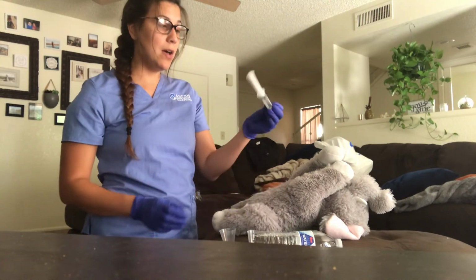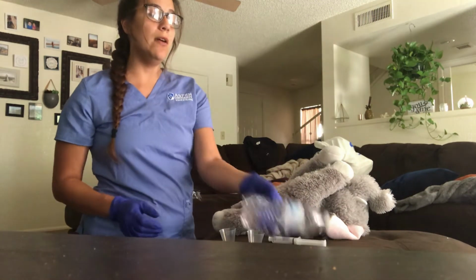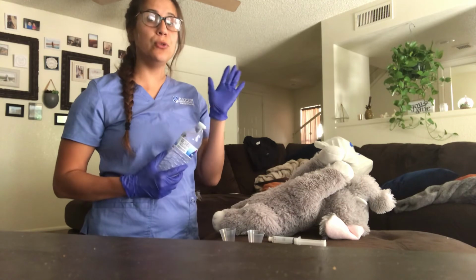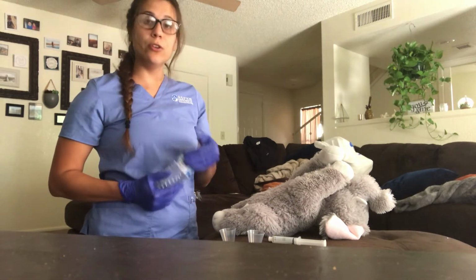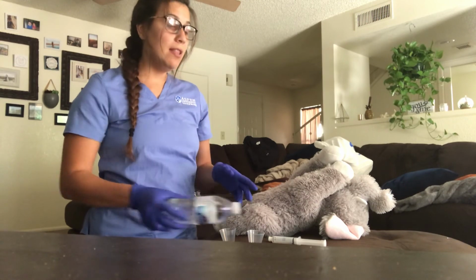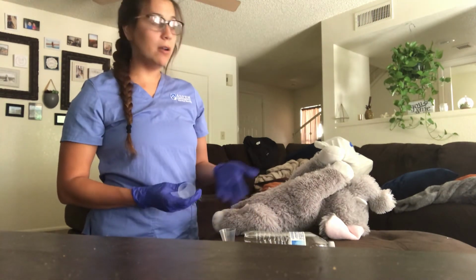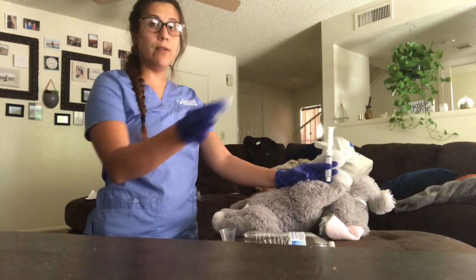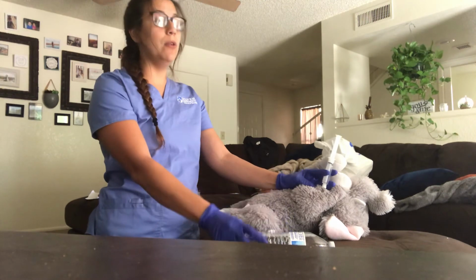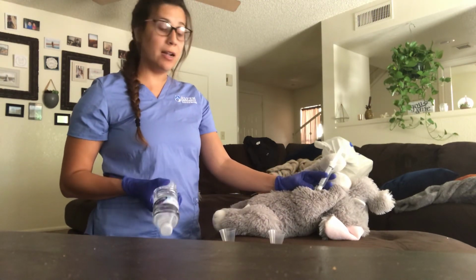So you would go ahead and connect your syringe to the NG tube. You would want to go ahead and flush it first. So you're always going to flush the NG tube with 30 milliliters of water before giving any medications. Then you would go ahead, once you flush it with that 30 milliliters of water, you're going to go ahead and pour the first medication in. Once the medication goes down, you are going to flush it again with 5 to 10 milliliters of water.